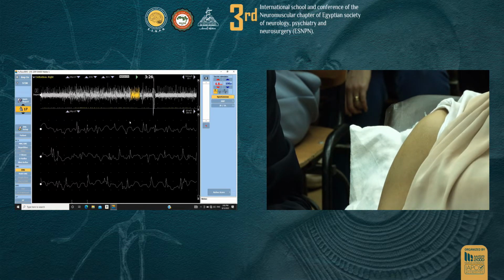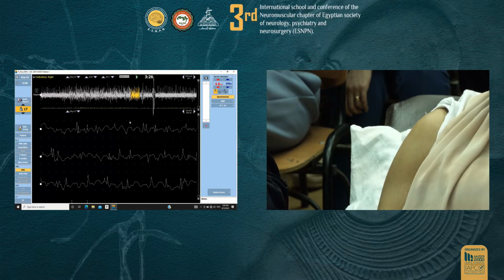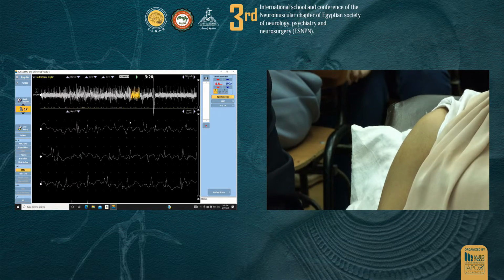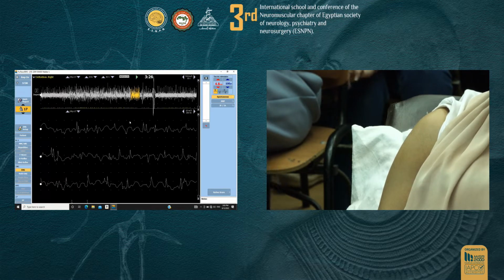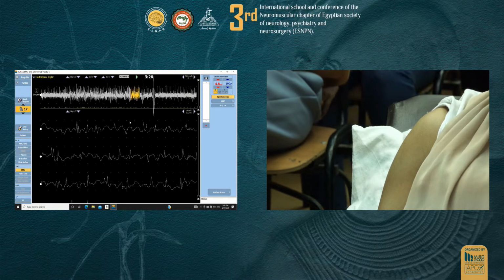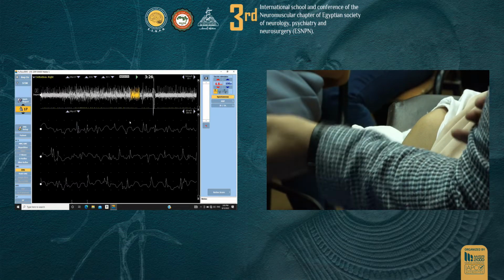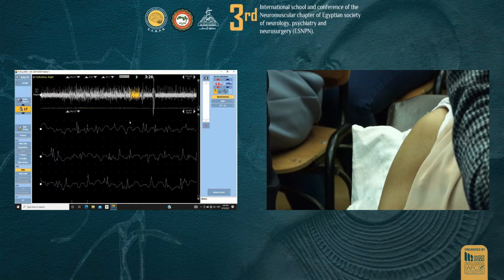Maybe also you have two kinds of needles. The 35. Do you have the other needle? Give me some more gel, please. Do you use the same in your EV lab over here? Different machine and whatever? Same machine and same electrode and everything? Yeah, I think so. Maybe too much. Yes, that's the problem.